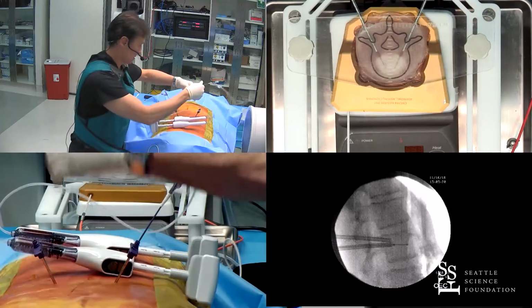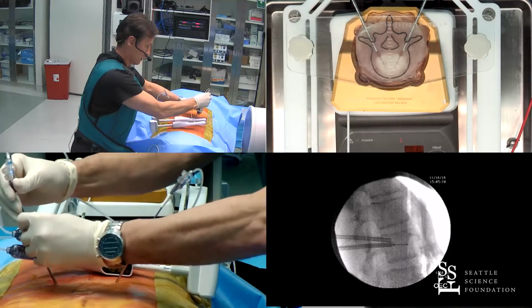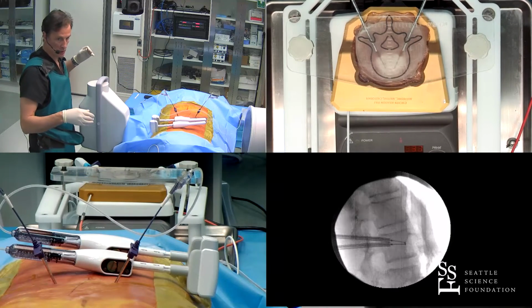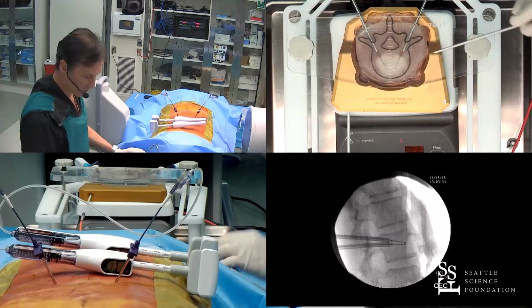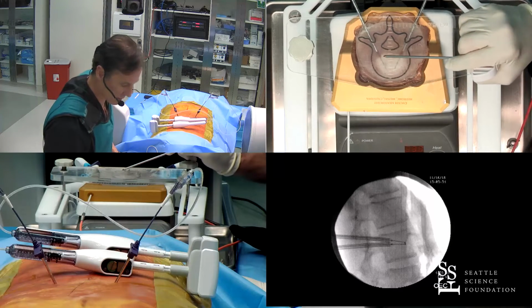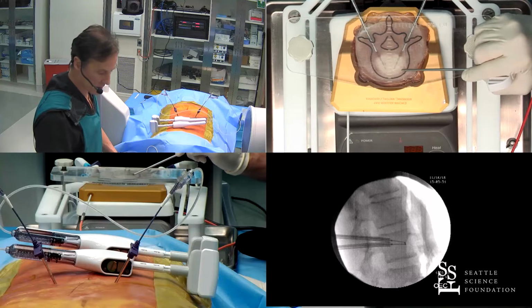Sorry, Doug, to go back to the question for the ablation, how far beyond the proximal marker does the ablation take place? So I'm going to direct our attention back to the chicken breast. Here is the distal tip and then the proximal tip, and this is kind of the center of this big elliptical lesion. This provides a nice large burn.